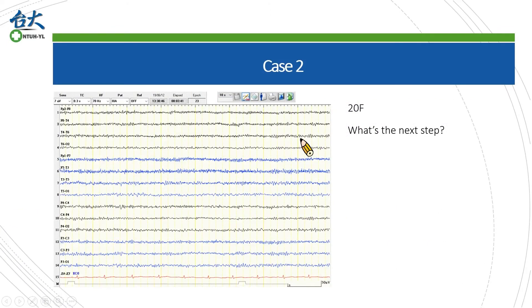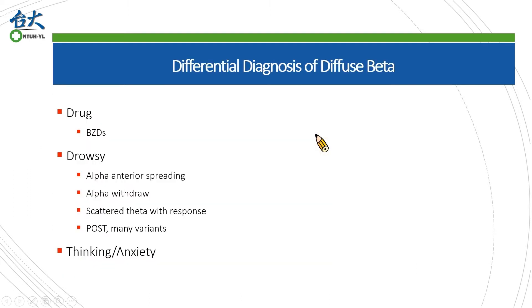Let's move to our next case. At first glance we do not see any obvious feature except the background. The alpha rhythm is not significant and the beta activity has a broader distribution. When we think about diffuse beta activities, here's the differential diagnosis. First, we may think the patient may have taken benzodiazepines. Some may regard diffuse beta as a feature of drowsiness.